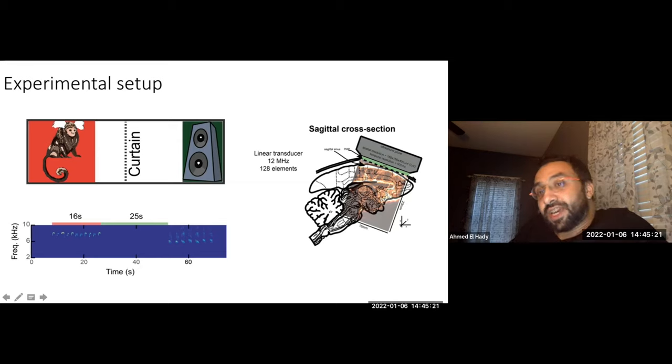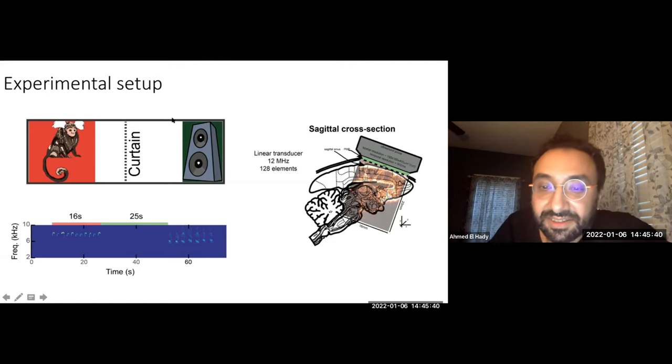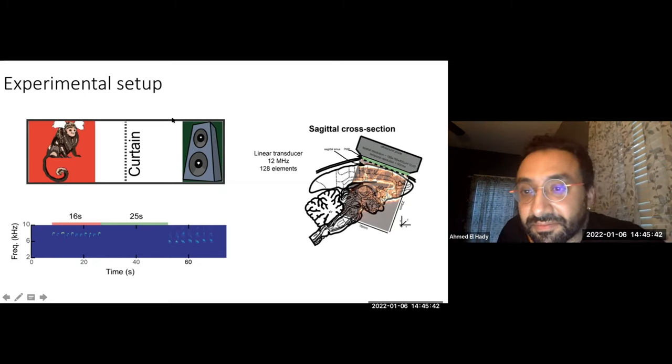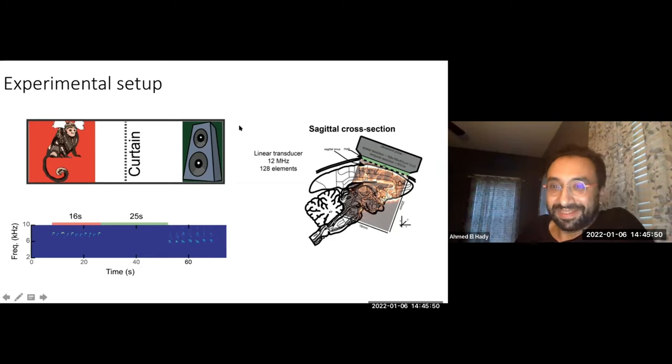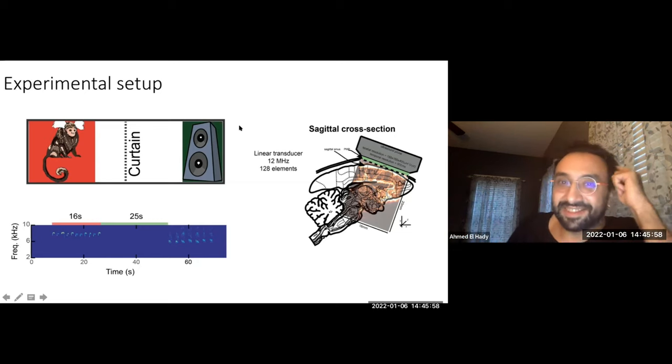We are able to image at a 20 millimeter depth and 16 millimeter in the anterior-posterior axis in the sagittal orientation. So while the marmoset has the probe attached to it and the imaging is happening... So what about the thickness of the slice? It's always one slice. The thickness is 400 micrometers. Can you do whole brain imaging in general? I will address this at the end.